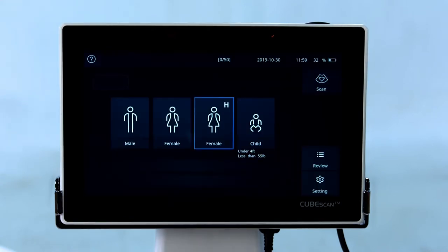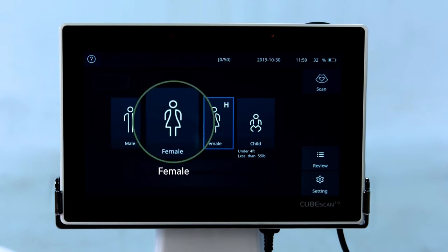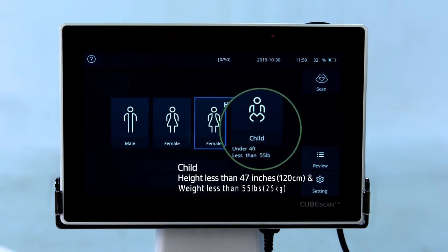Select the appropriate patient type. There are four types: male, female, female with hysterectomy, and child.